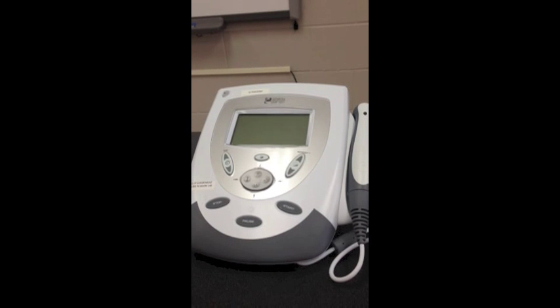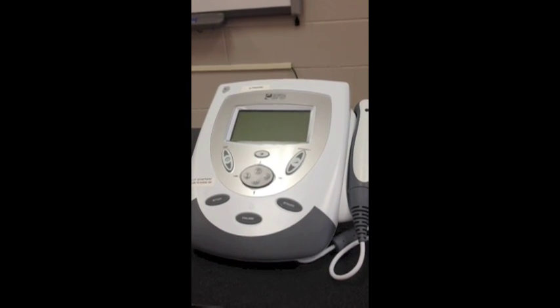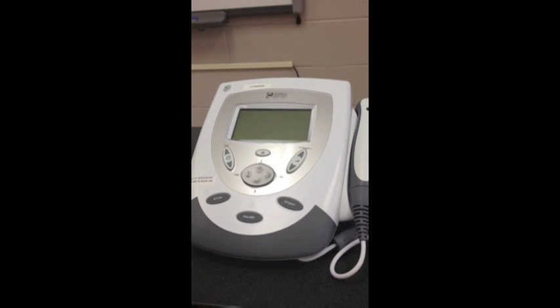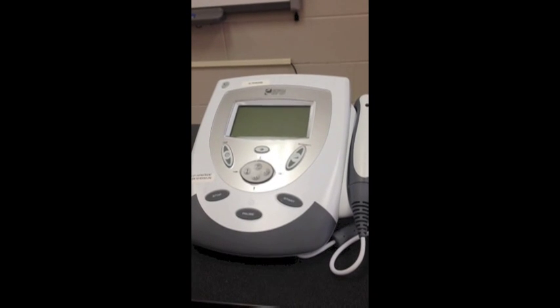Indications for use. Soft tissue shortening, calcific tendinitis, osteoarthritis, rheumatoid arthritis, lateral epicondylitis, subacute or chronic inflammation such as bursitis, carpal tunnel syndrome, trigger points, acute low back pain from prolapsed disc, tendon healing, wound healing, and herpes zoster.